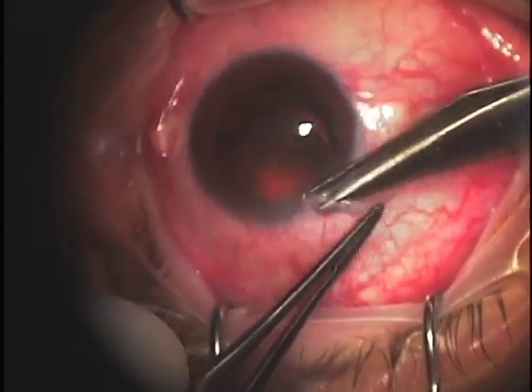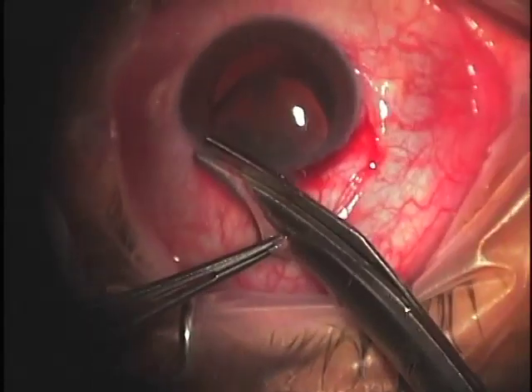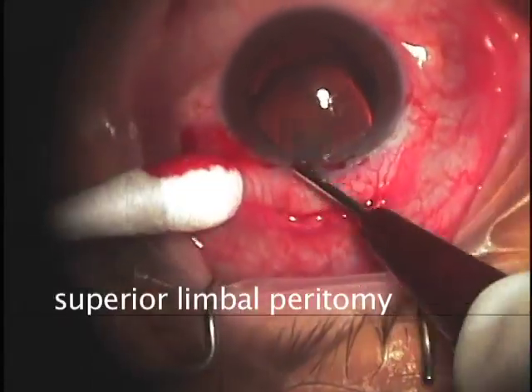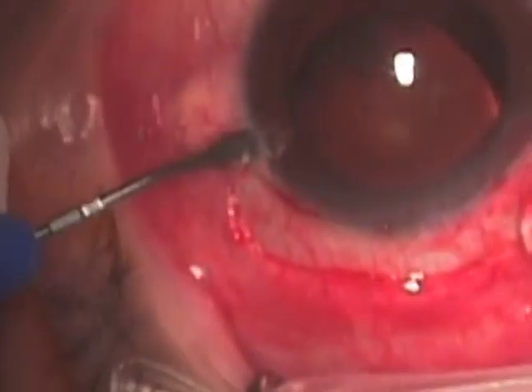In this procedure, the conjunctiva is recessed from the superior limbus using Westcott scissors and toothed forceps, and we can achieve hemostasis with diathermy or cautery.